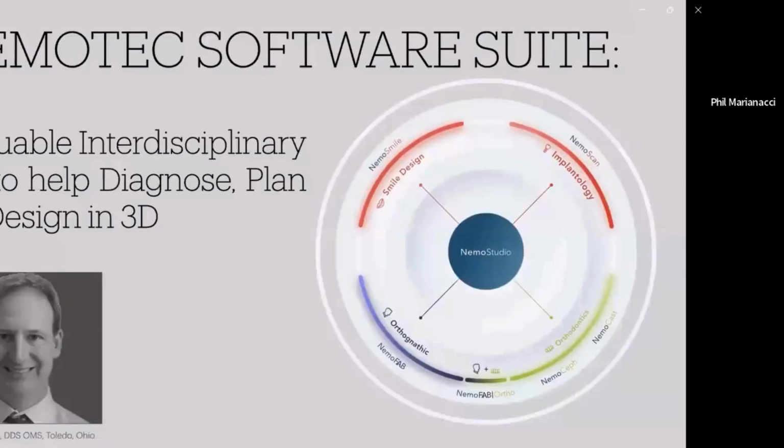So again, I hope you'll see that Nemo is a very unique software suite of different applications to give you complete total control of the case from all different vantages for planning purposes. And if you have any questions, be sure to reach out to Phil with 360 or to local Nemotec advisors, and they can get you started or provide other in-office demos. Thank you very much for your time.